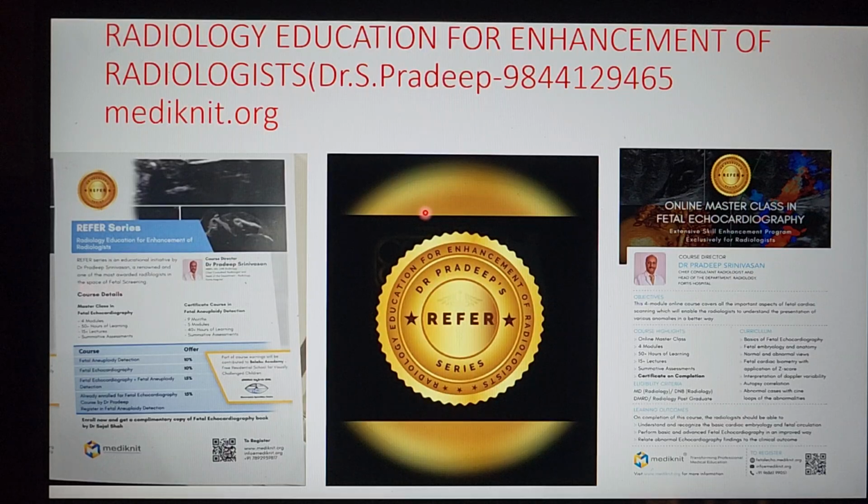Happy learning. Before I finish, I would like to say that this case, which we meticulously diagnosed perfectly as TGA, had 3 other anomaly scans done elsewhere where every report said the heart was normal.